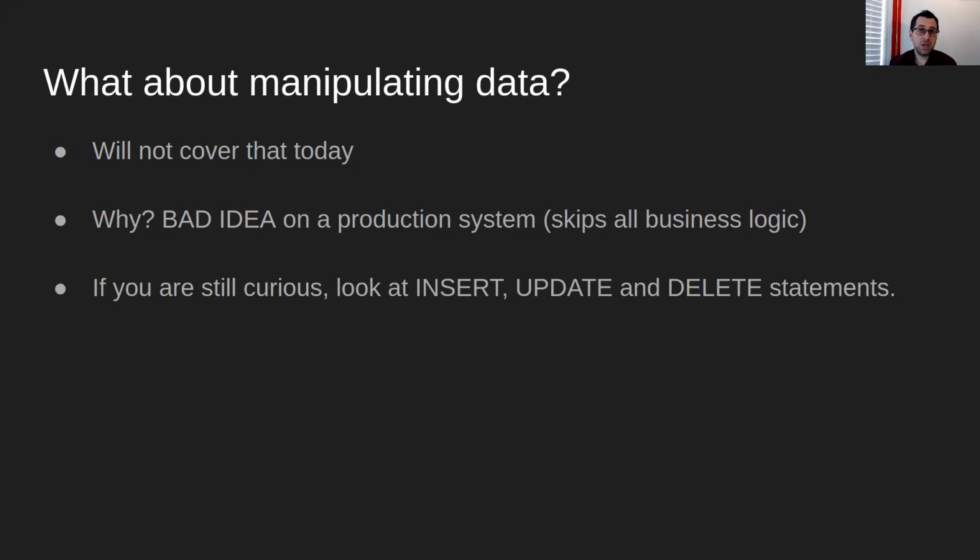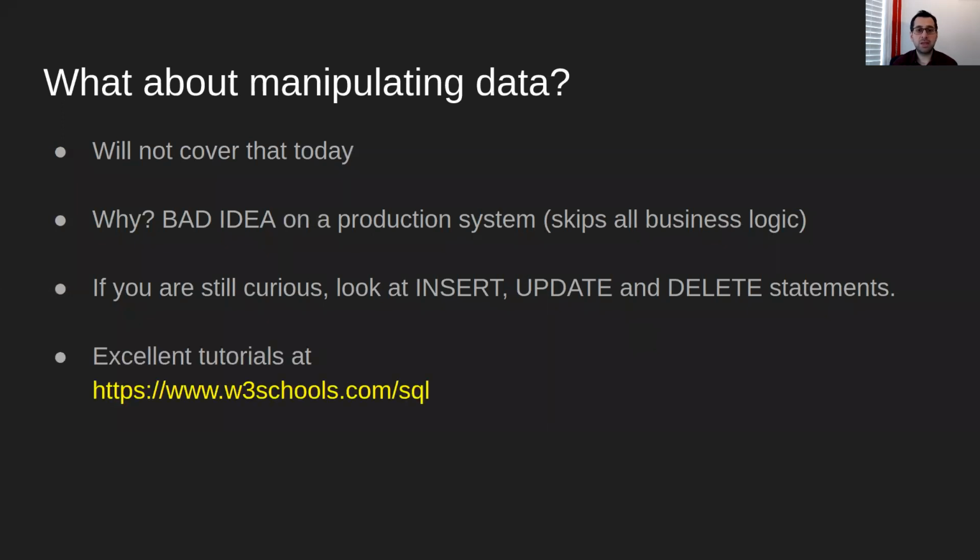If you're really curious, you can look. I will provide a link to some tutorials online. So the vocabulary is insert for adding new rows, update for updating information in existing rows, and delete for deleting rows. However, also keep in mind that most likely your vendor, if they give you access to a database, is only going to give you read-only access anyway. So there's a link there. This link is an excellent, easy to follow tutorial that you could try.